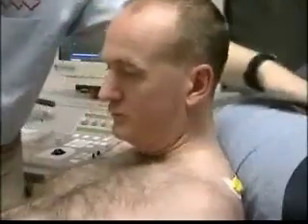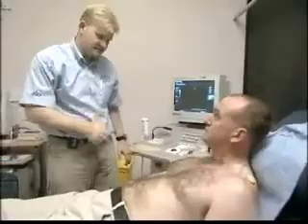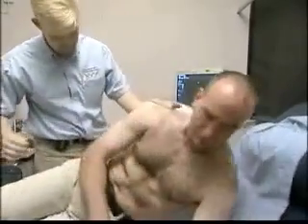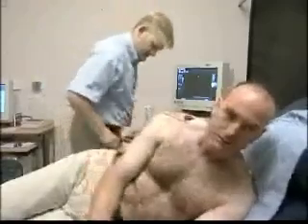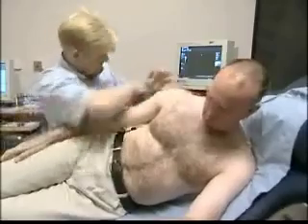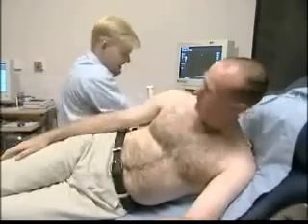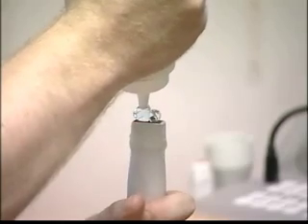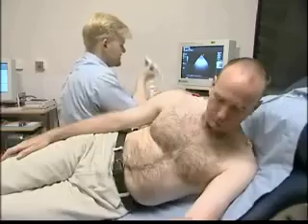The patient is asked to roll onto their left-hand side so the lungs drop out of the way, since ultrasound cannot see through air. Because even a thin layer of air will reflect the ultrasound signal, a coupling gel is used between the ultrasound transducer and the patient.